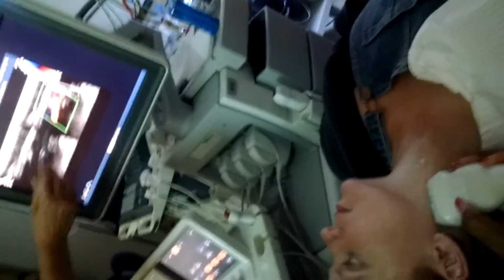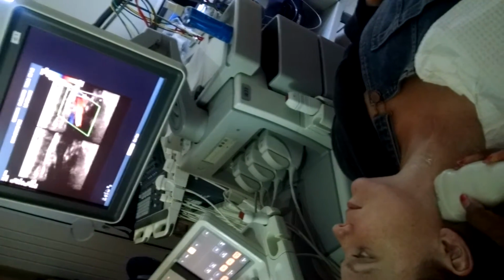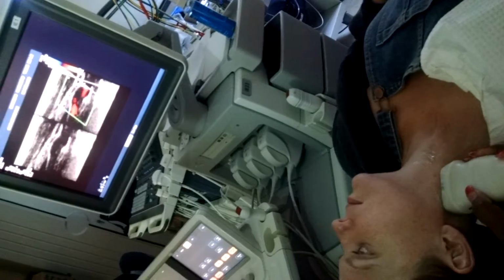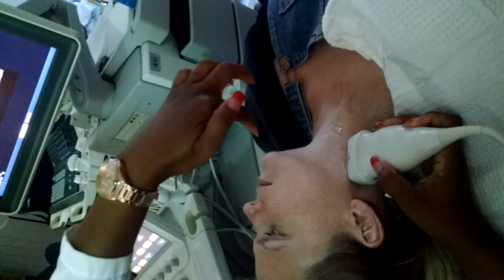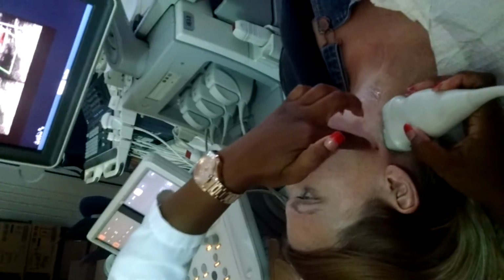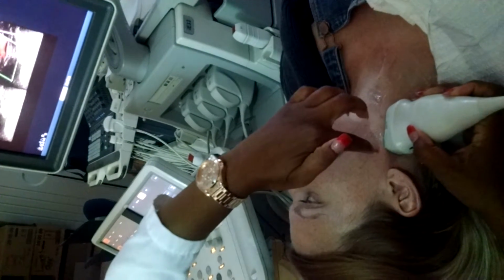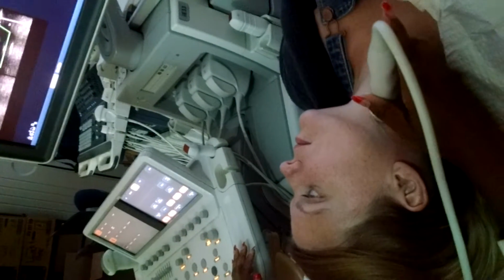What is the darkness on both of them? Is that the jugular? Yeah, that's jugular. It may be a little jugular coming in because I see color. And then I can go back to the bulb and then go more medial. I'm just shooting the beam more towards her nose. So lateral, down towards her ear, shooting the beam is more ICA because the ICA sits more posterior lateral and the ECA sits more anterior medial. So I get a little bit of ECA here, but I may have to slide more anteriorly.